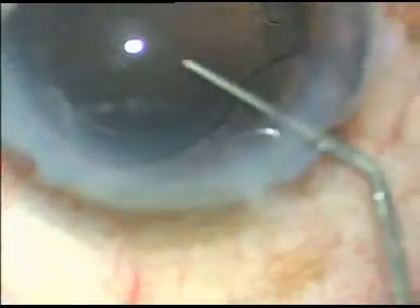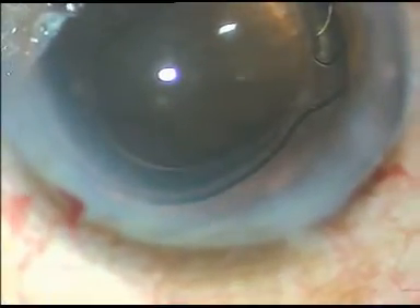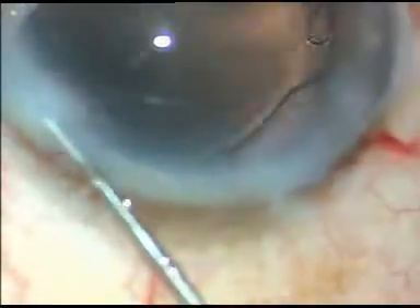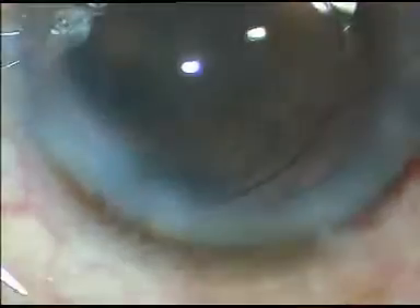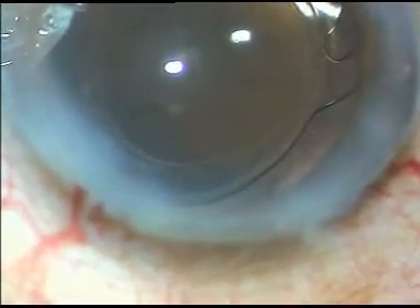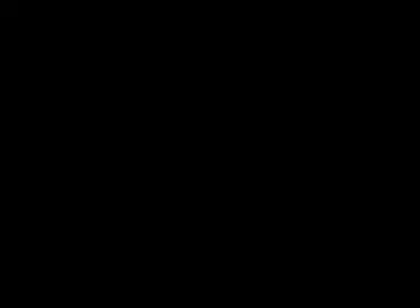A little bit of moxifloxacin is given and the side ports are hydrated, and that's it. The case is done. Before finishing, under higher magnification, I do a final wash to check if there is any cotton fiber or debris. The chamber is formed and the case is over. Thank you very much.